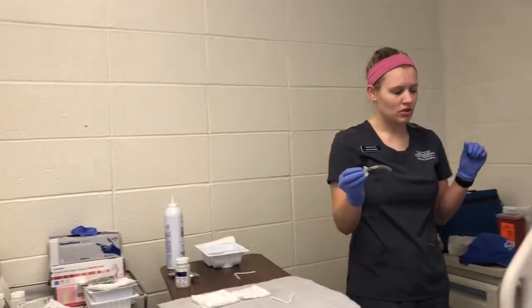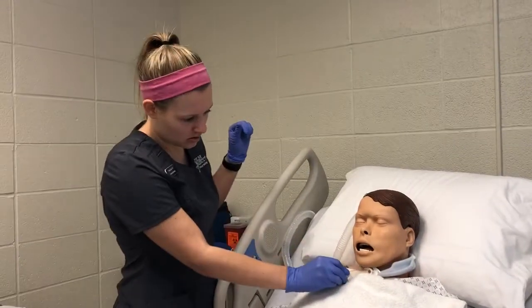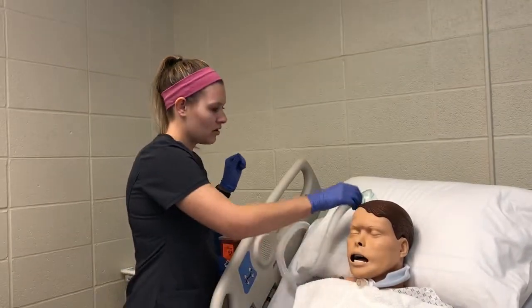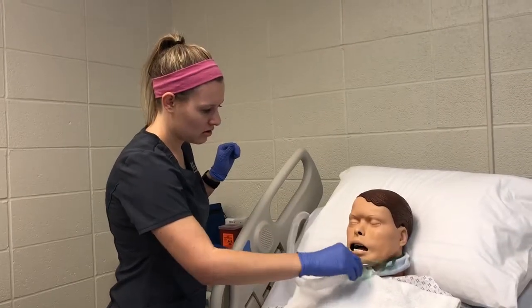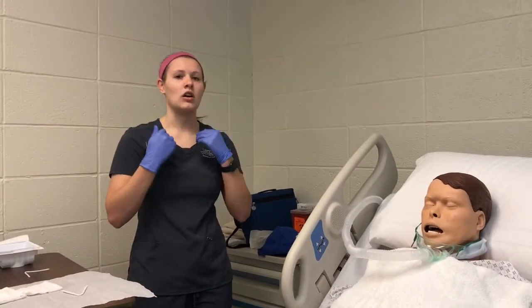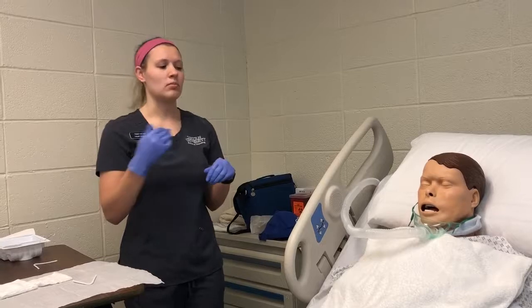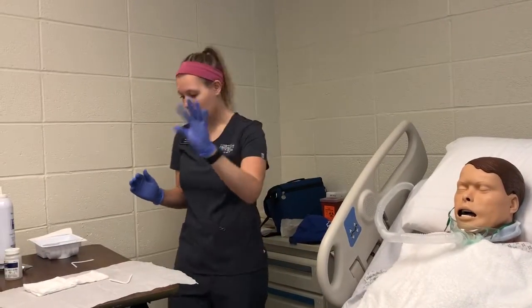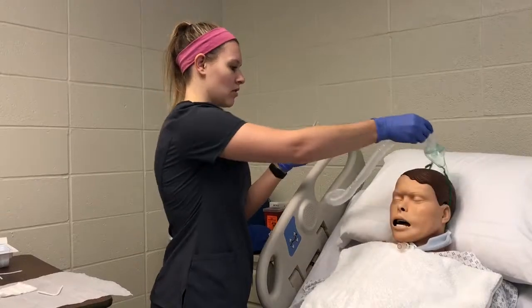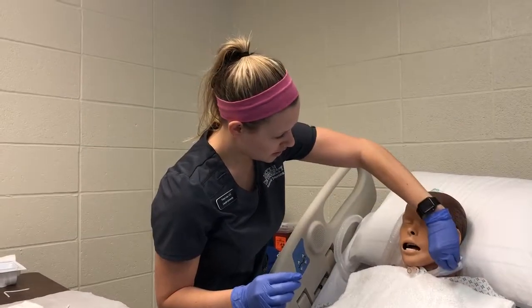Okay. So now we're going to put this back into the patient's trach. There we go. And put our oxygen back on just for a minute. Now I'm going to want to change the dressing that I took off underneath, put a new one on, and do some trach care, or some cleaning around the trach area. So I still have my sterile hand here. Use some normal saline or sterile water. Take that off again, and this is sterile. Just gonna kind of clean under the trach.